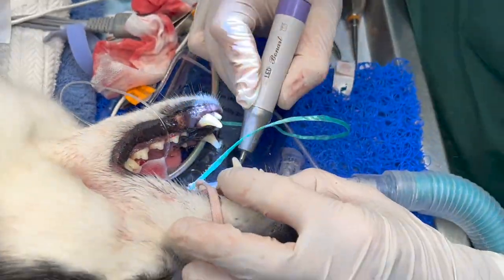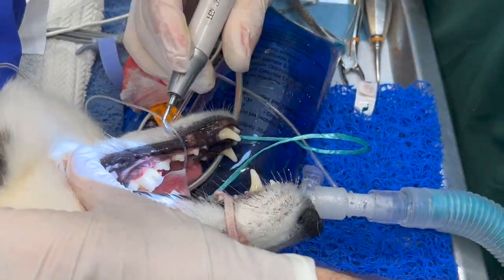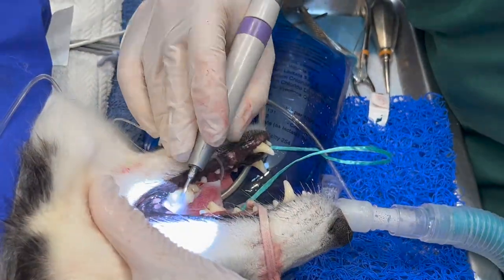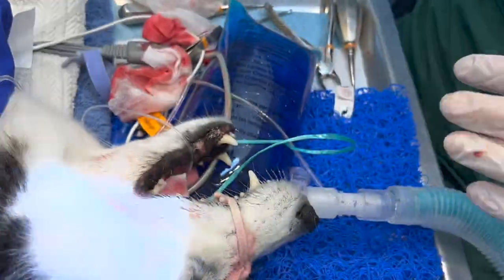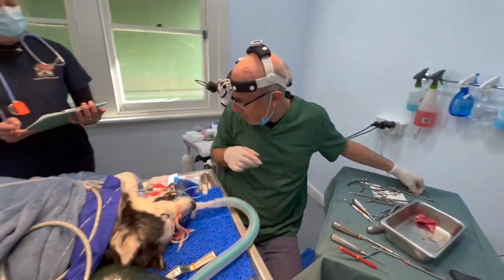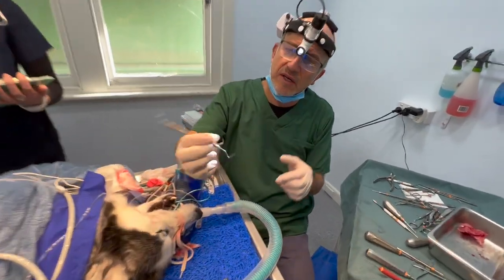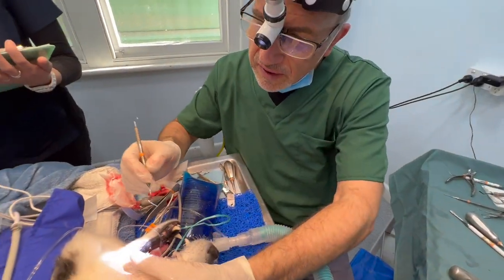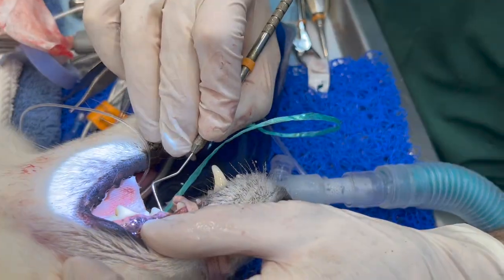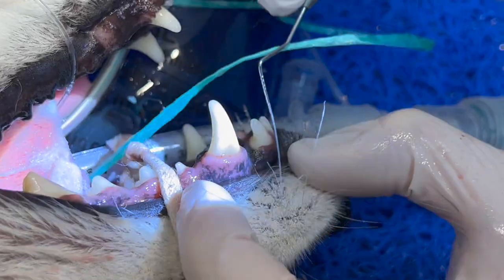The mouth is pretty good — already looking very good. This owner keeps his dog's teeth really clean. When we examine a dog's mouth, we use a dental probe just like a regular dentist does. Here's my probe and you can see the graduations on it. Now that I've finished the site, I'll quickly have a feel. You can see healthy gum — it doesn't even go in a millimeter. So you're checking to see how far it goes in. The oral cavity is really good.